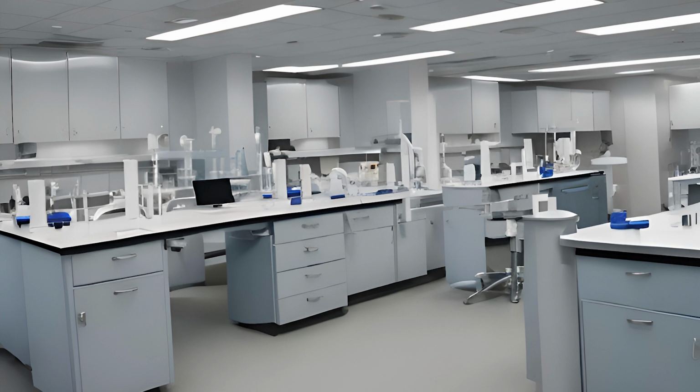Following the order of draw, you're going to place your evacuated tube system tubes in the holder and advance them onto the needle. You don't want to pull up, press down, or move the needle back and forth or sideways, because if you swing that sharp, pointy edge of the needle inside somebody's vein, it can hit the other walls of the vein and puncture out the side or the back of the vein and lacerate it. This can cause the vein to effectively rupture underneath the skin, and you'll see a sudden swelling up to the size of a golf ball.